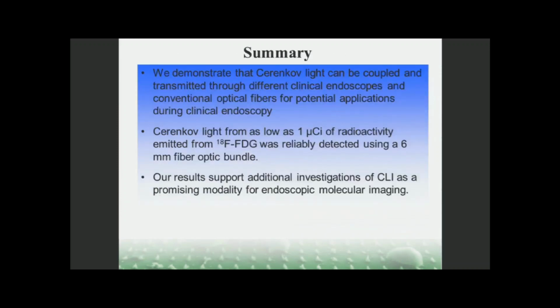And lastly, I think we demonstrate the concept of using Cerenkov luminescence imaging for endoscope application. Although 1 microcurie is not so great, it is still clinically relevant. We still believe the CLE is a promising modality for future clinical application.